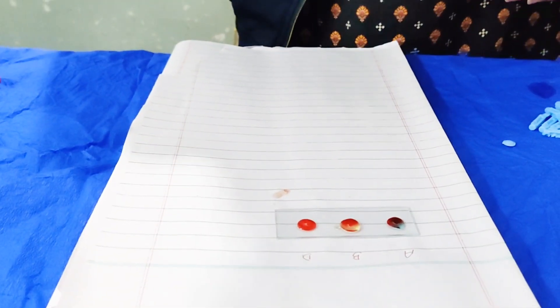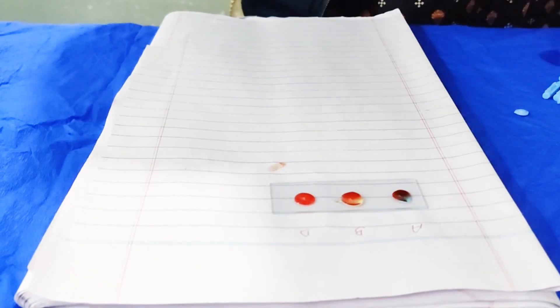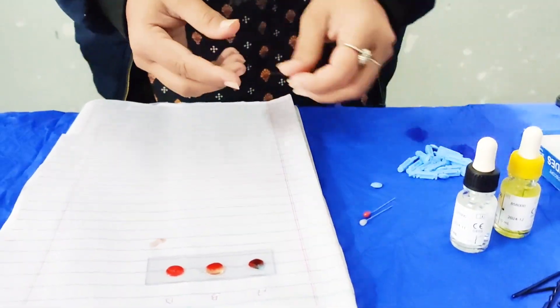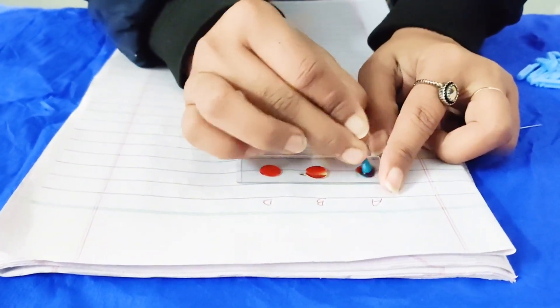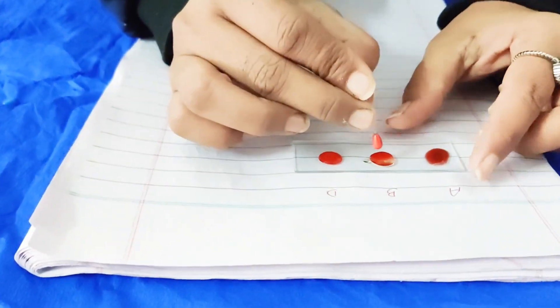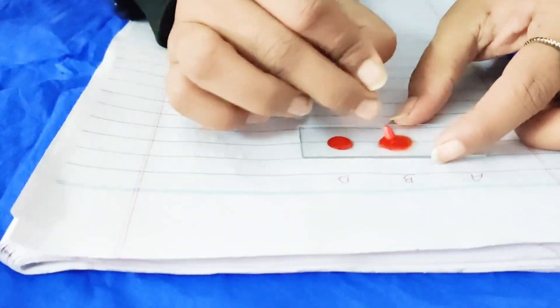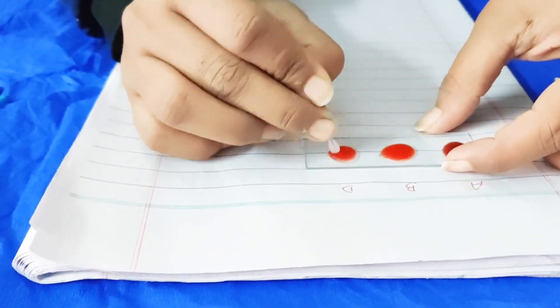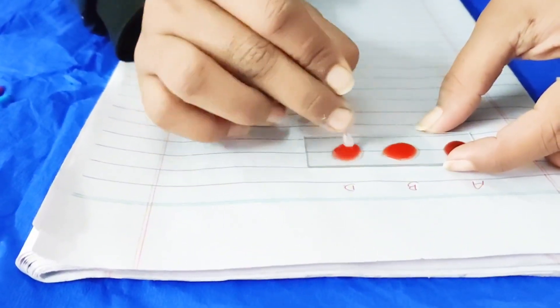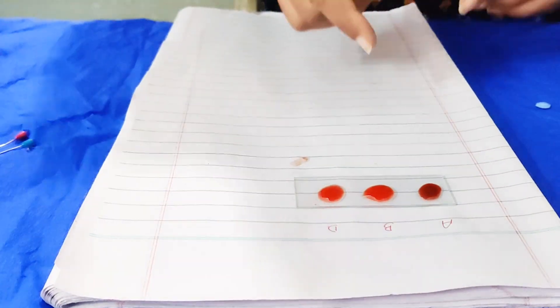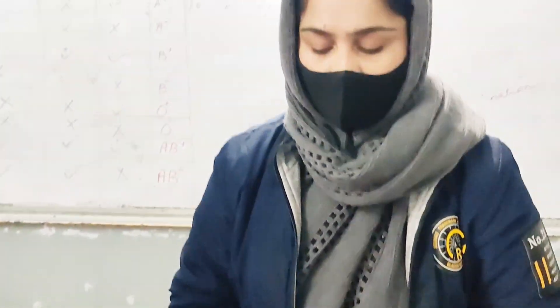We can blend using anything, but because the proper tool is not available, I will use a pin for blending. We will not blend with a pen because then we will not know the correct blood group. We will blend each drop properly with its respective anti-sera, so we will know the blood group.